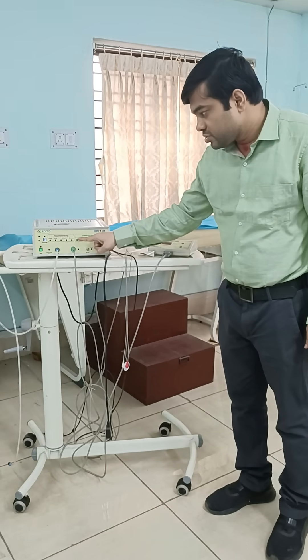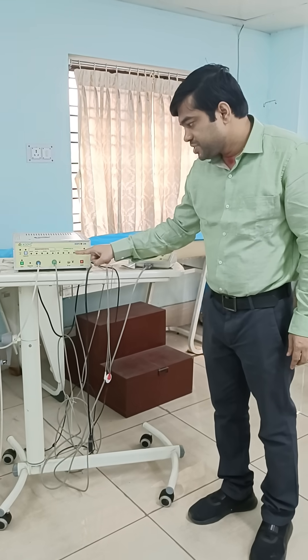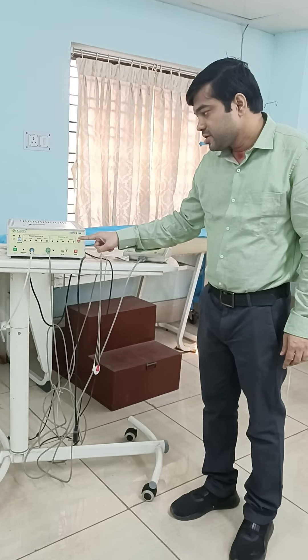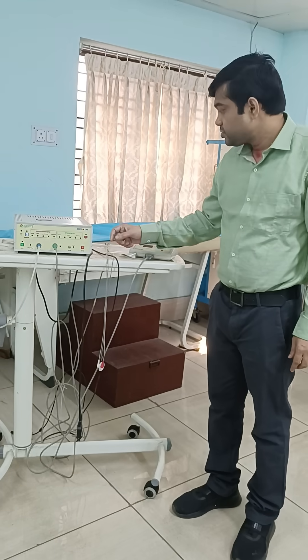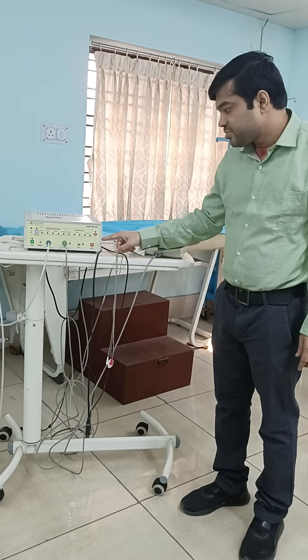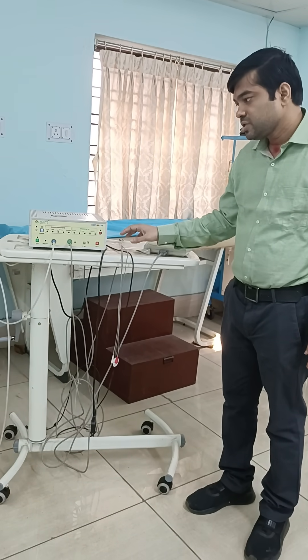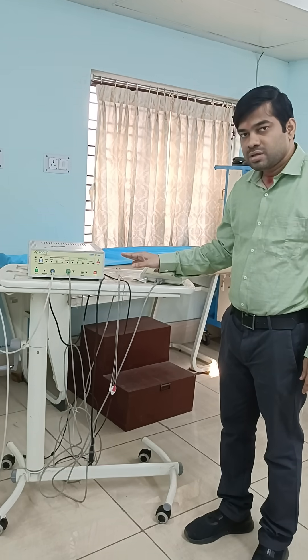For sympathetic function, we have to find out the BP supine, BP standing, and blood pressure with hand grip. Heart rate variability will also be seen in this report.